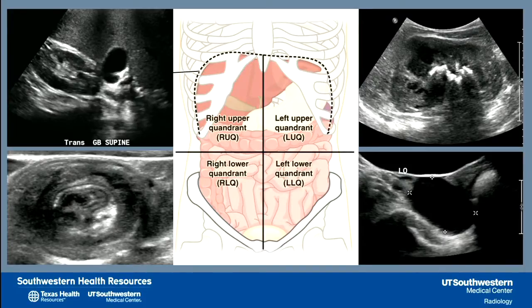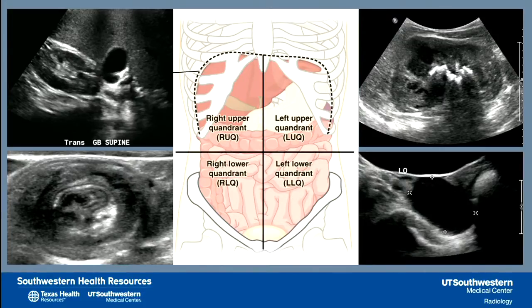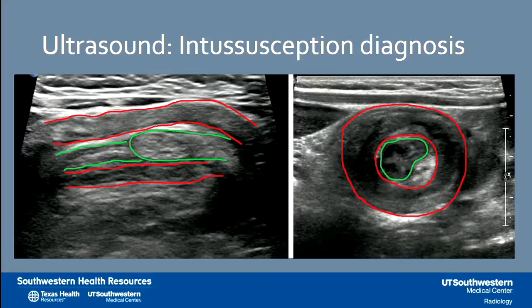In the right lower quadrant, I'll give you a second to look at the image and come up with what you think the diagnosis might be. I showed this to a couple of friends who are not imagers, and the knee-jerk reaction is appendicitis. In this case, no — this is ileocolic intussusception, an entity where the small bowel essentially telescopes into the colon. The green outlines the small bowel that has telescoped into the red structure, which is the colon, shown in both transverse and longitudinal planes. The risk is that with time, ischemia and necrosis can develop, the bowel can perforate, and the child may need to have that section of bowel removed.